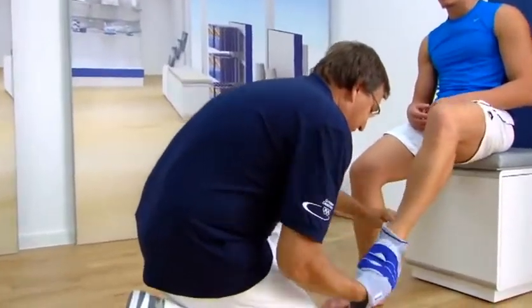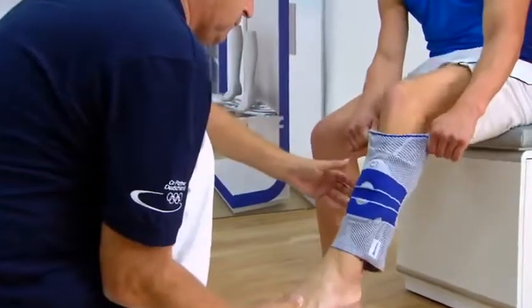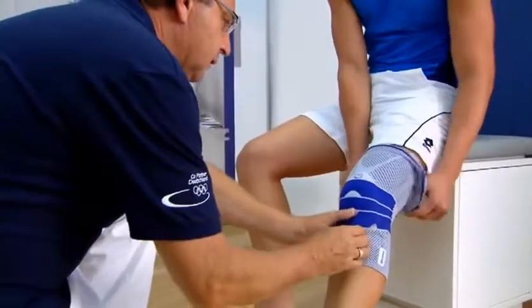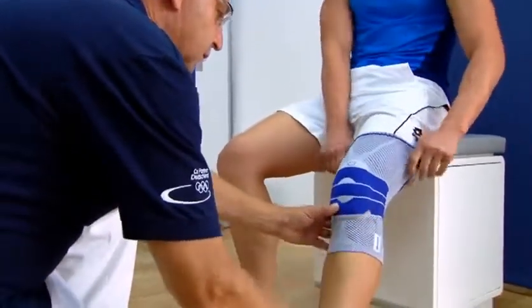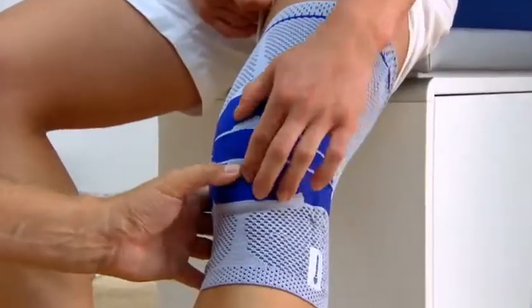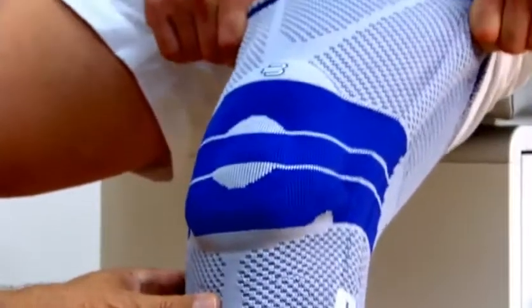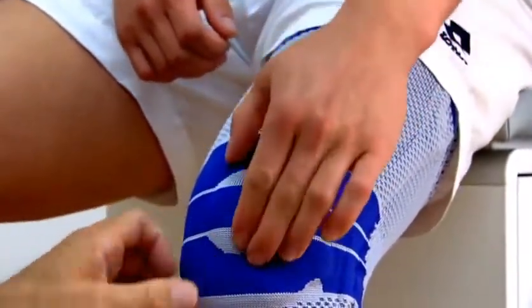The Genutrain is put on under supervision of an orthotist or trained specialist. Important: reach into both sides of the donning aids with the thumbs and pull the support steadily upward. The Genutrain is easier to put on if the knee is bent. You can tell that the Genutrain is positioned correctly if the lower edge of the kneecap is precisely in line with the inside edge of the Omega Pad.